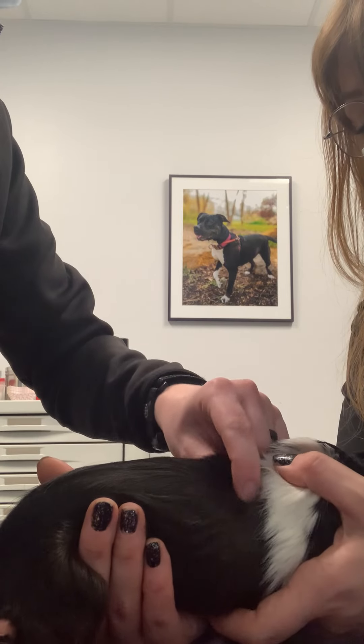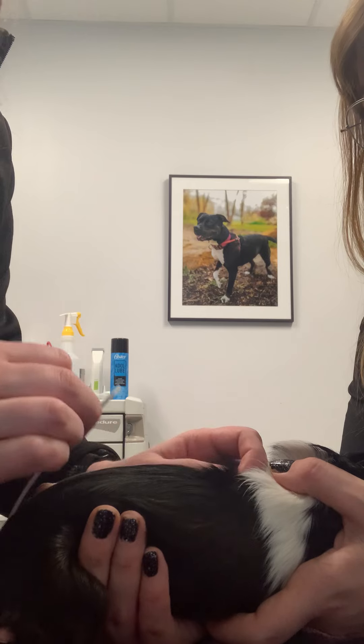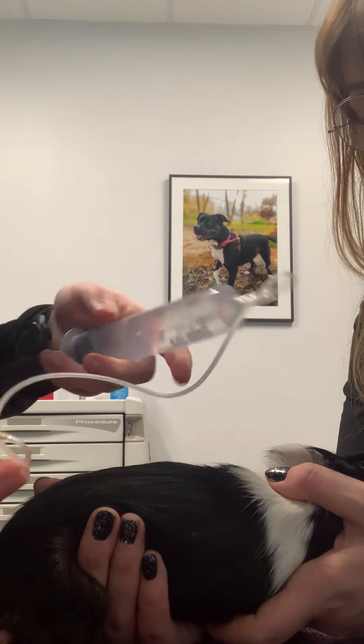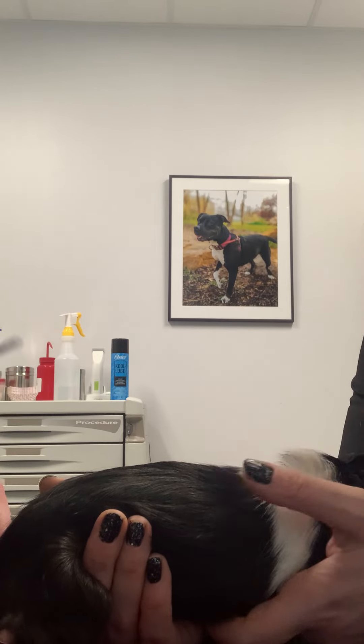We'll tent the skin between the shoulder blades, we'll insert the needle parallel to their body, and then we'll just give the fluids as fast as we can. You can give them their fluids with a bag, but oftentimes we find that a syringe with a 19 gauge butterfly catheter is a little bit easier.